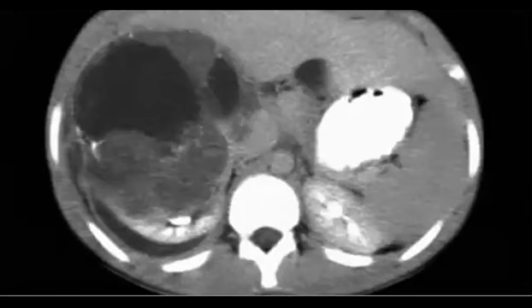Nephroblastomatosis is the precursor of Wilms. Thank you. Yes, Joanna, thank you. It is the precursor for Wilms, and it is bilateral. It comes bilateral, so when we go to the ultrasound, we should search for them. Okay, so let's go to this case.